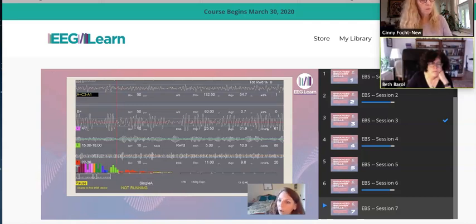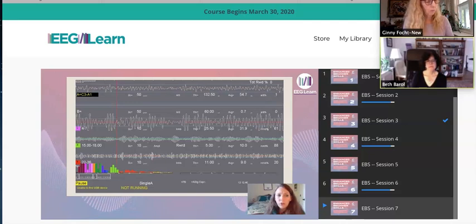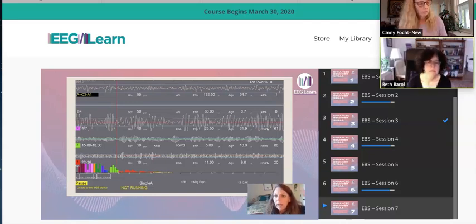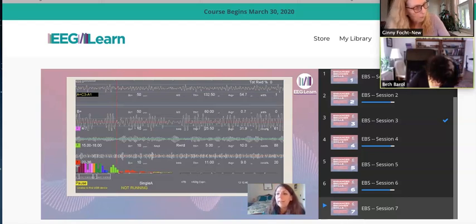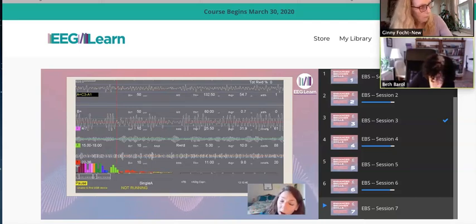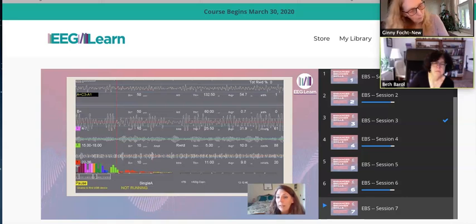If I look over at the percentage, and I know that a 35% inhibit is kind of a moderate challenge on slow wave, I have narrowed that threshold and lowered that limbo bar so that now instead of that activity being outside the threshold 35% of the time, it's outside the threshold 61% of the time. So that's just a tougher challenge level.